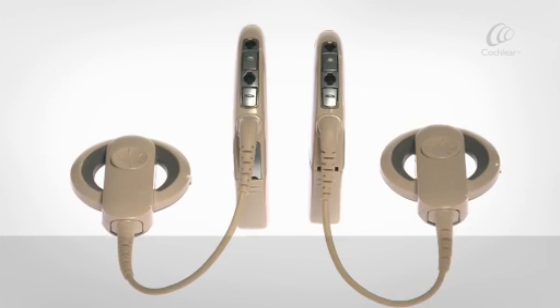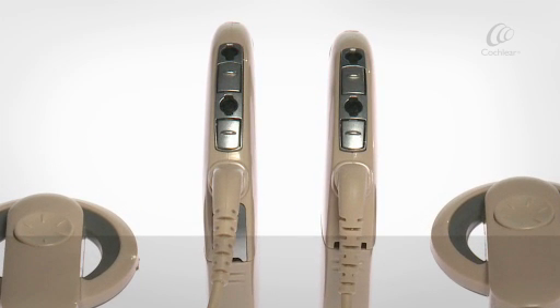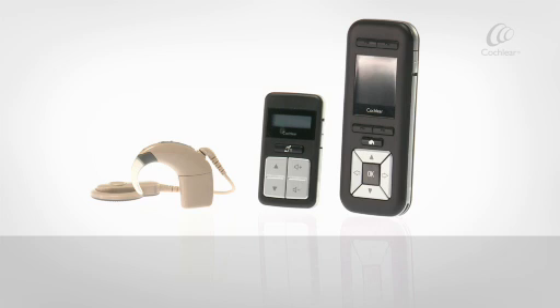You can control your sound processor as a standalone device by pressing buttons on the processor. You can also choose a Cochlear Nucleus CR210 remote control or CR230 remote assistant to control your processor.